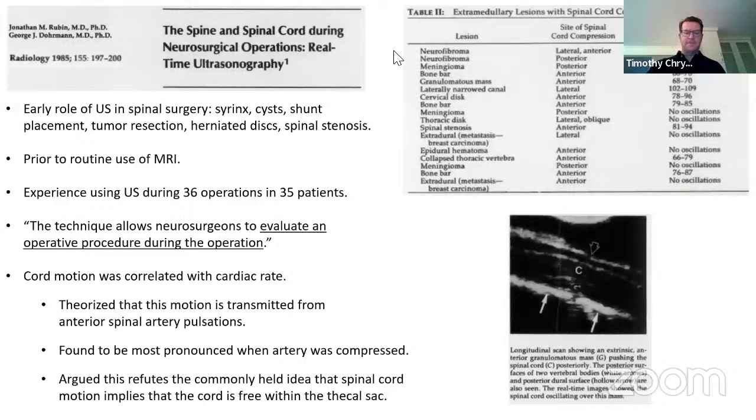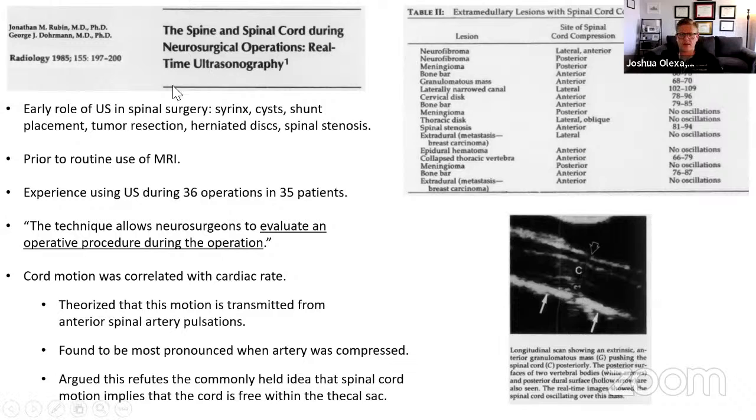Yeah, that's a very hot topic. What are going to be the indications exactly for expansile duroplasty? And we certainly feel ultrasound can have a role in deciding when that's necessary. I think the exact parameters, what precisely those are beyond the obvious cord swelling, aren't established yet. Currently it's really, again, qualitative. It's this idea of the sausage cord phenomenon, constriction of the dura, which you can see under ultrasound at least. So it's a very nice modality for that.